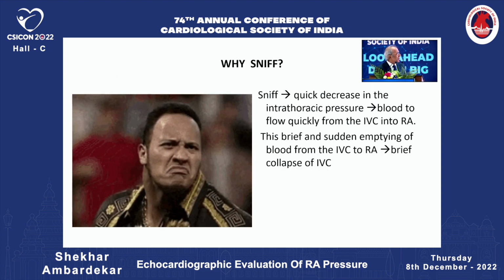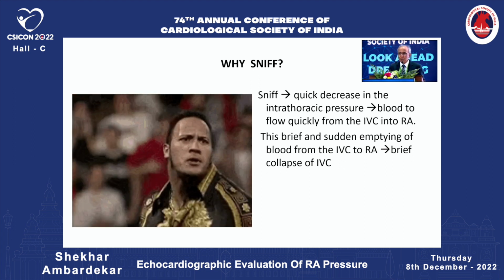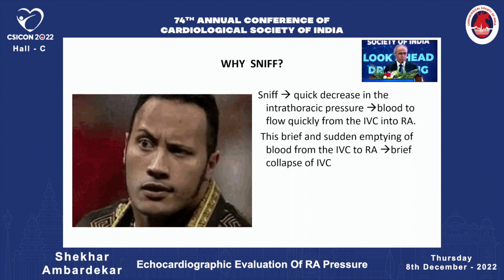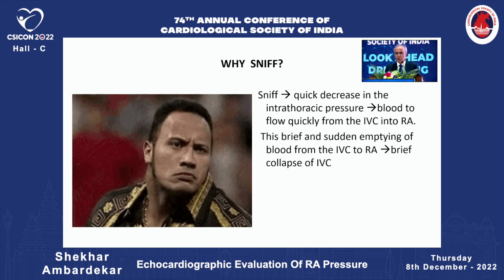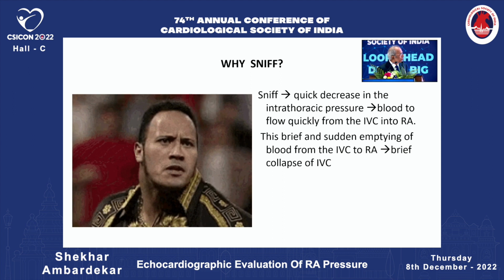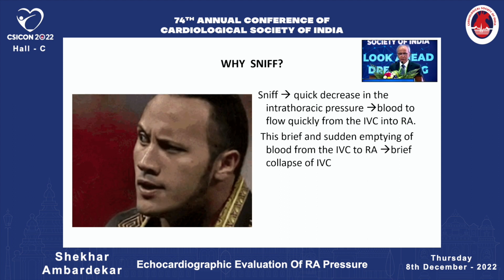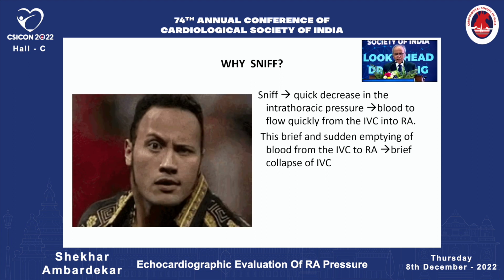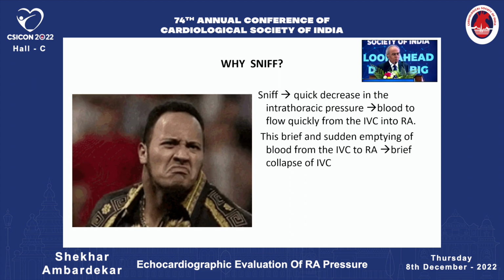Now, for collapsibility, we should not depend on quiet respiration, but we should ask the patient for a sniff. With a sniff, in a short time, the patient takes a short deep breath, and with that there is a sudden decrease in the intrathoracic pressure, and the IVC will collapse quickly, and that's what we should see. The thing that I commonly do in the room when I am doing the patient's echocardiography, I just say, "Arey, kya baas aa rahi hai na?" So the patient just does that, because if you just ask the patient to sniff, they generally don't understand what they are supposed to do.